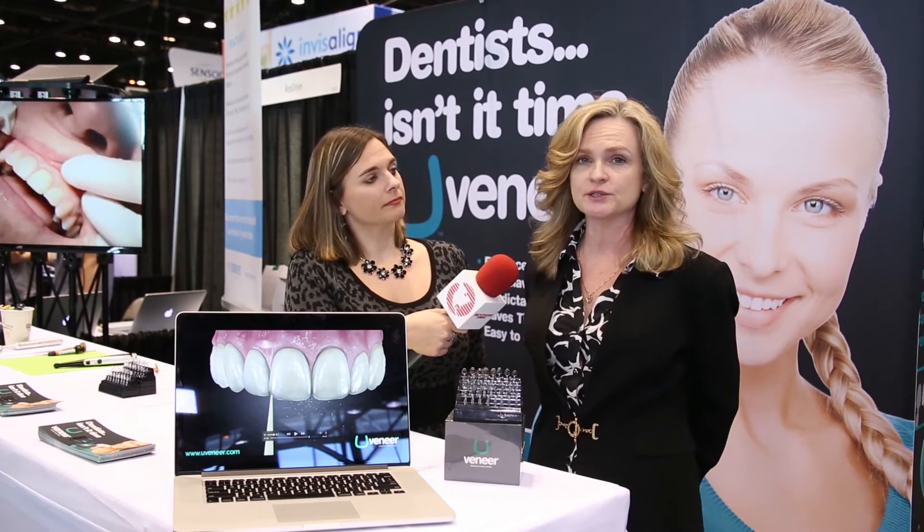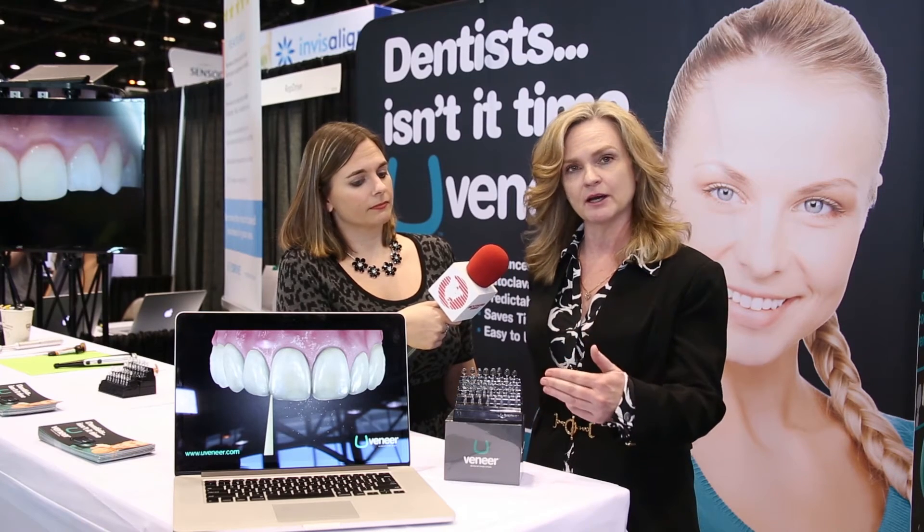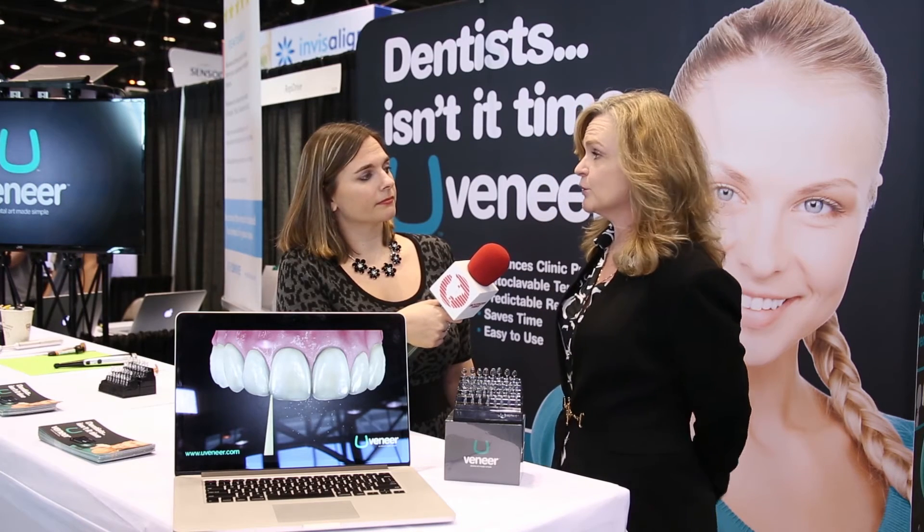What's included in the Uveneer system? In our system it comes in a little kit and it is fully autoclavable, so you can use these again and again and get well over a hundred uses out of it. We have two sizes in our kit: large and medium. With each size, you get the upper and the lower. And within each set, you have your central, lateral, canine, and this one you use on your first and second premolar. So you can go anywhere from a single tooth or up to 10 teeth per arch.